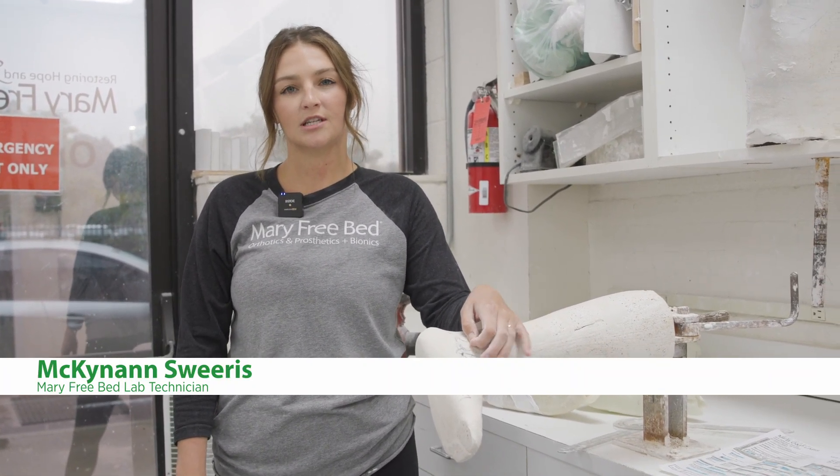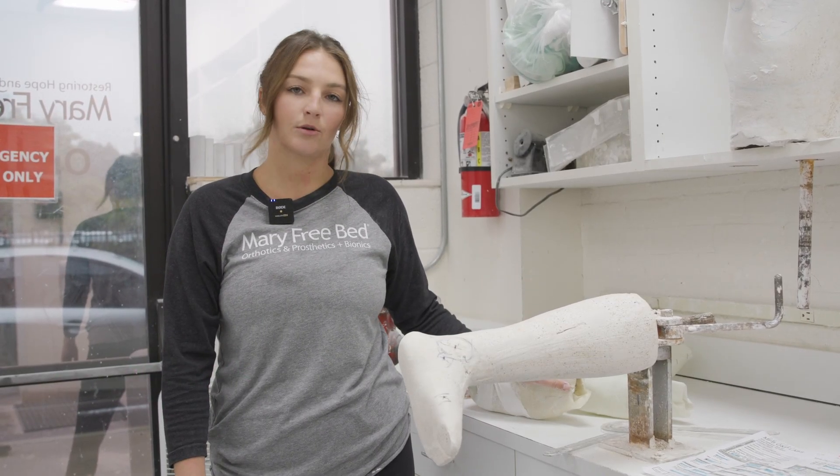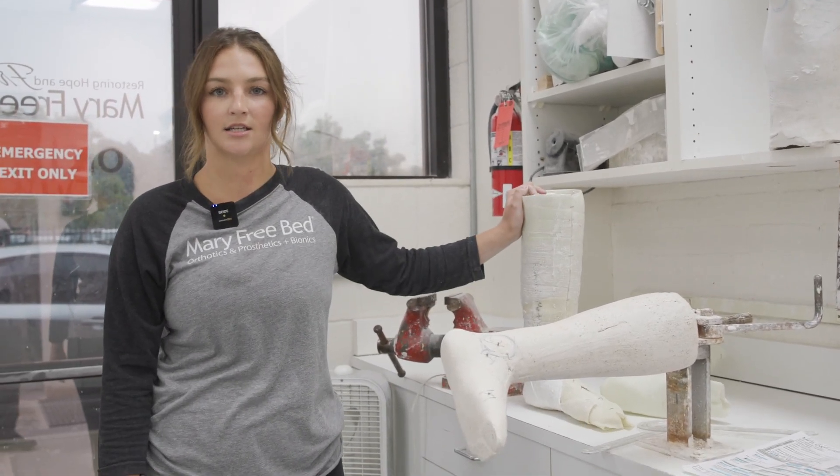Hi, my name is McKinnon. I've been working at Mary Free Bed for almost two years now. Today we're going to go over the cast that we received from the hospital and other labs, and we're going to modify an AFO with Tamaracks and also a stop as well.